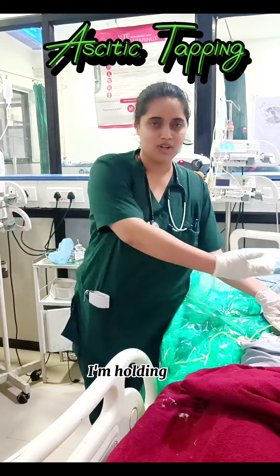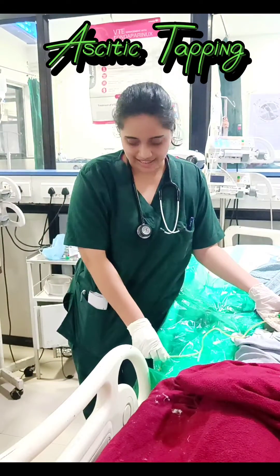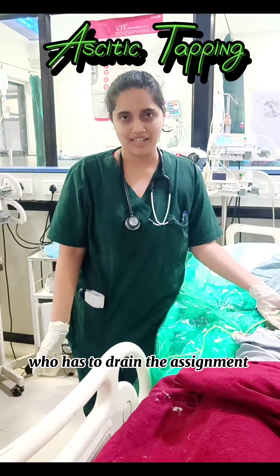As I am standing here, I am holding the needle with the connector so as to drain the ascitic fluid.